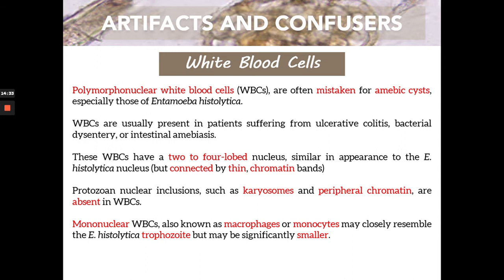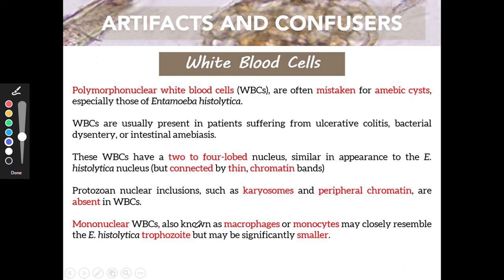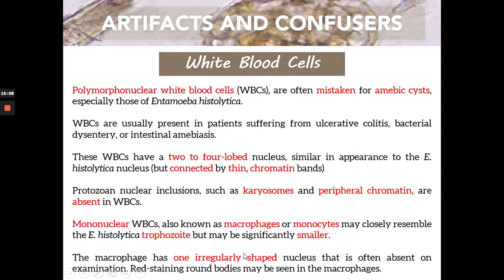Your mononuclear WBCs — usually referring to macrophages or monocytes — may resemble Entamoeba histolytica trophozoites. They may be smaller in size compared to trophozoites. The macrophage has one irregularly shaped nucleus, and there are some red-staining round bodies that can be seen in macrophages that are absent in trophozoites. These are some defining features for differentiating WBCs from amoebic cysts or trophozoites.